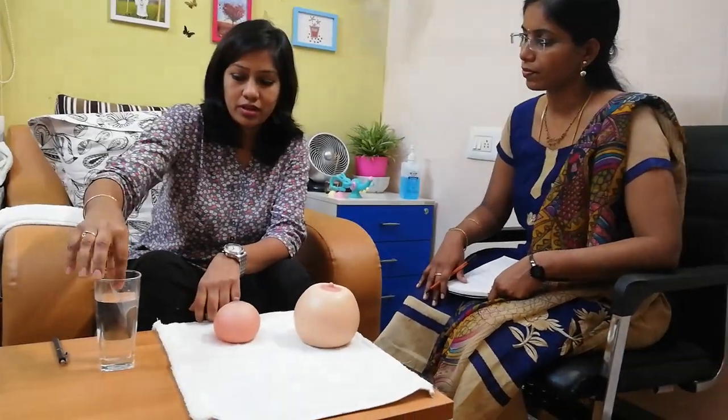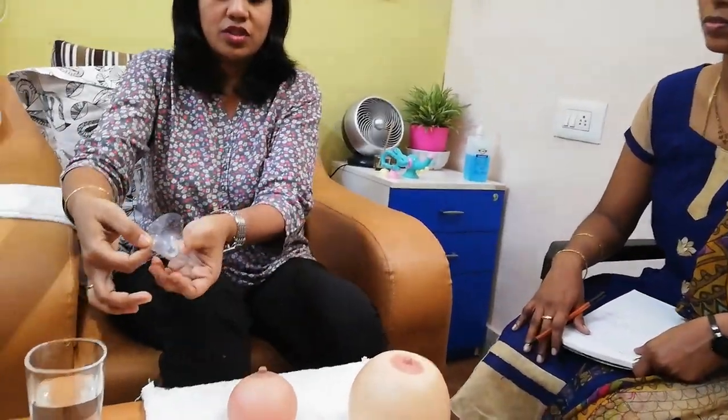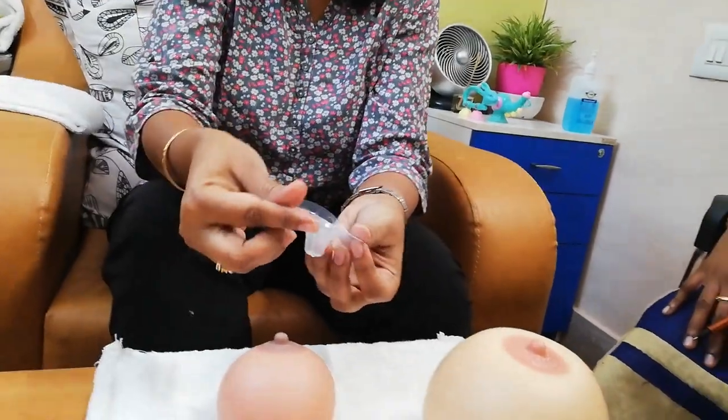How to use nipple shields? Let's see how to use a nipple shield today as we got to the size of breast. First of all I would like to show you — you will be asking why I kept it inside water. This is hot water; I kept the shield inside hot water so this shield will become hot.